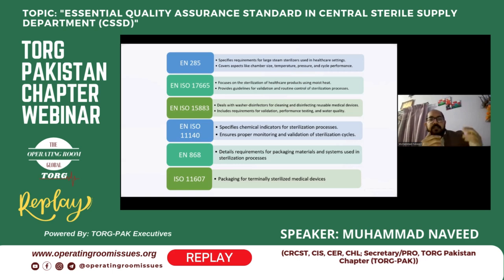EN 868 gives detailed requirements for packaging material and specific sterilization processes. The requirements will allow the team to utilize them in the healthcare setting and plan. This quality assurance indicator, can you hear me?